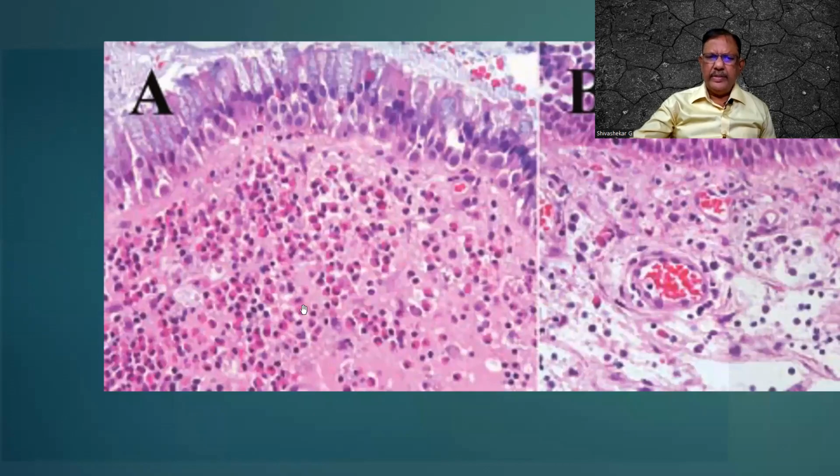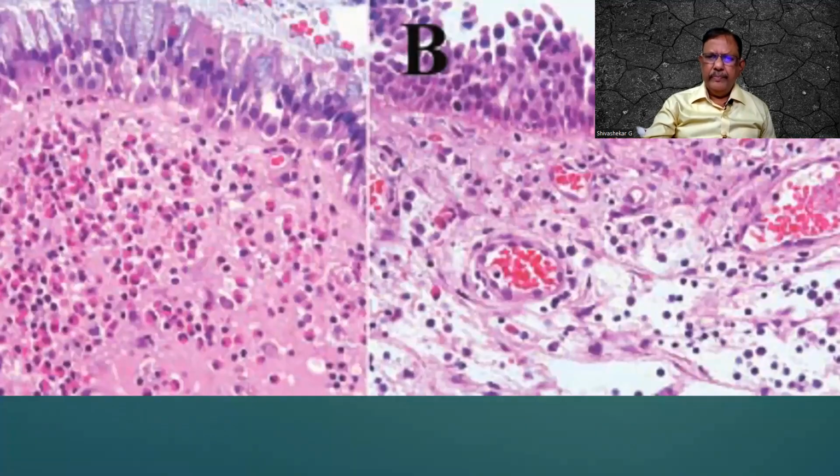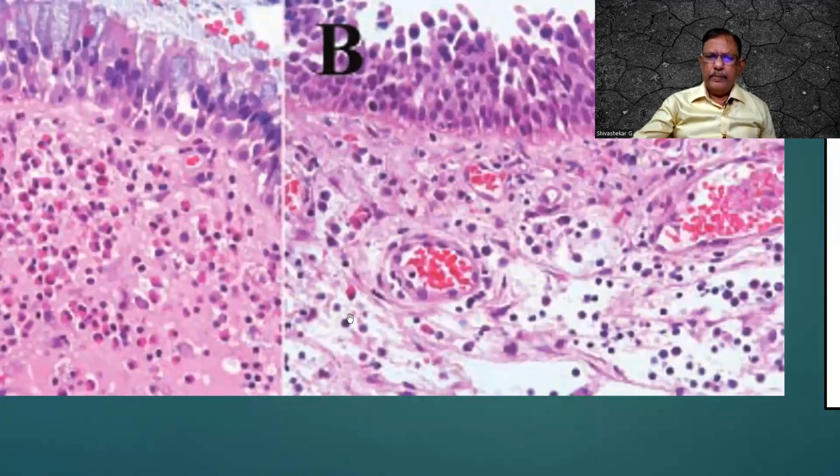So, this is what we are seeing. I am finding eosinophils in this here, and there are some lymphocytes. Also, in this case, I find the clear space. So there is edema. And there are a lot of these dark blue cells, which are none other than lymphocytes. And look at the vessels, blood vessels, they are congested. Congested means stasis filled with blood.